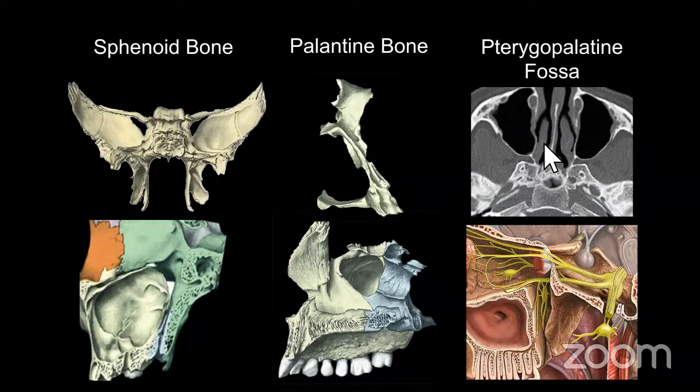And so when we look at the cross-sectional imaging right here, again, we'll go over a little bit more anatomy of the sphenoid bone. I won't bore you too much, but just realize there's a little foramen right here, which is the foramen of Vesalius, which contains a small little vessel. These are our friends right here, foramen ovale and foramen spinosum. This is the horizontal portion of the carotid canal. And then just medial to it, we can see an area of the bone that almost looks like it's torn or lacerated. And this is foramen lacerum. So this is where the carotid canal runs in the roof of foramen lacerum.